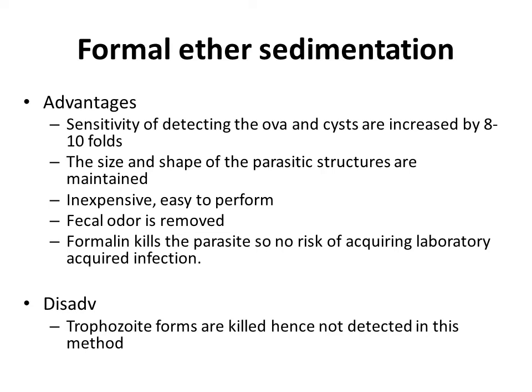The advantages: sensitivity for detecting ova and cysts is increased by 8 to 10 times compared with the wet mount preparation, because we are concentrating the parasitic stages. And the size and shape of the parasite is maintained because we are using formalin. This formalin acts as a preservative or fixative, so the size and morphology are maintained.